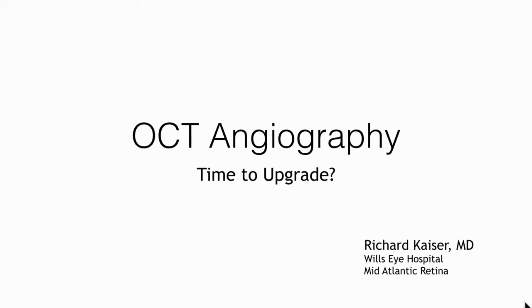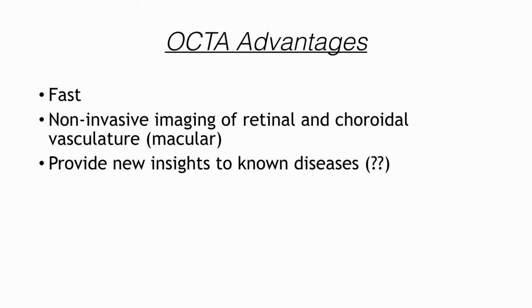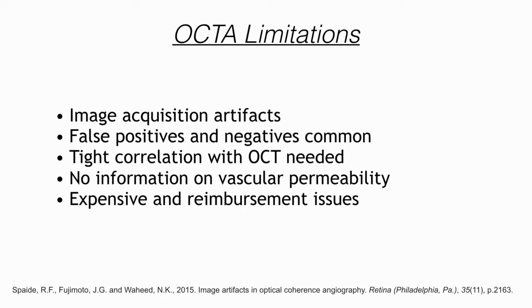Good afternoon. Is it time to convert to OCTA? Let's see. No financial disclosures. I want to thank Apton Shah-Ali. He's a true expert in this field. OCTA, it's fast, it's non-invasive, but does it really provide us any new insight to clinical diseases?